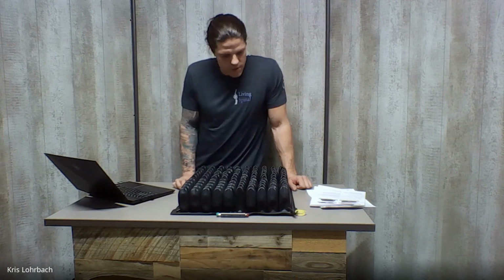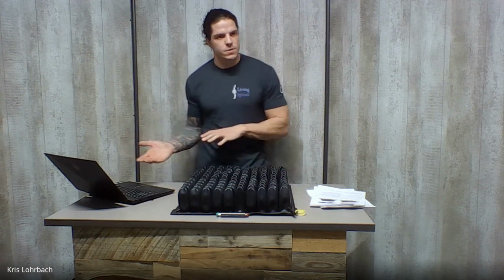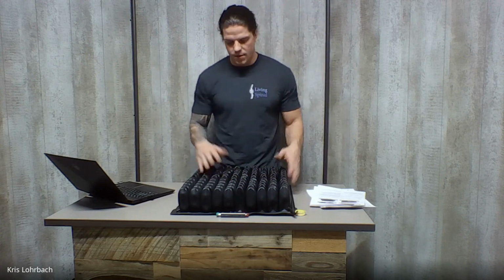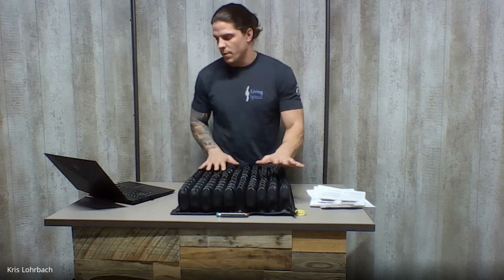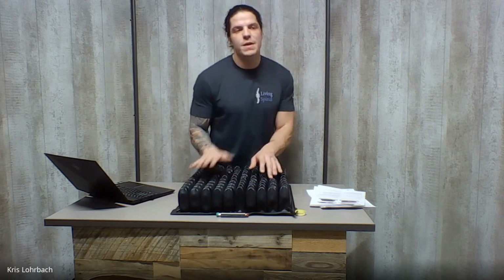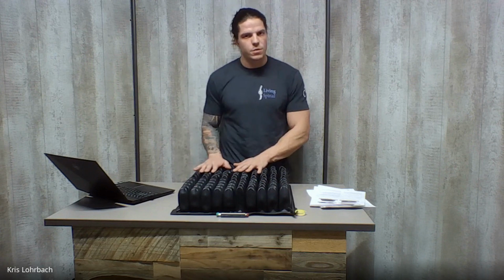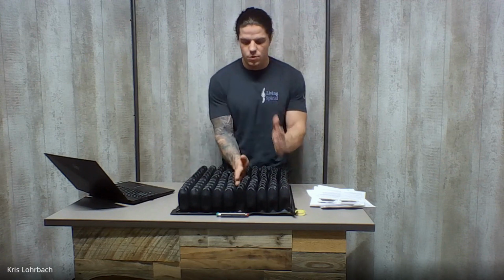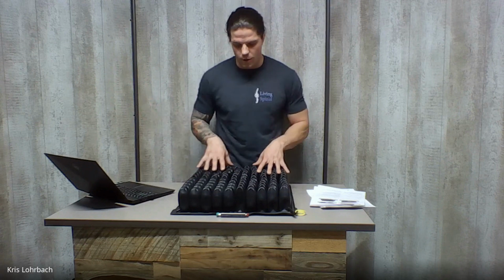So air cushions, definitely, as Andrew mentioned, the biggest drawback is they can cause imbalance, because if you lean to one side, the air is going to shift to the other side and keep you going that way. And as you mentioned too, the way they've controlled that is by creating different compartments. You'll see them in the name. It's usually, they'll call it a Roho single compartment cushion, meaning one big compartment. They also have Roho dual compartment cushions, which is usually one side and the other side. And then there's Roho Quattro, as you mentioned, where it's 4.